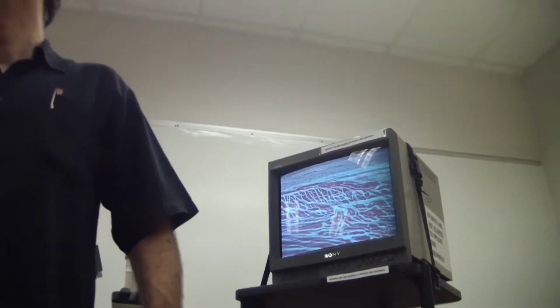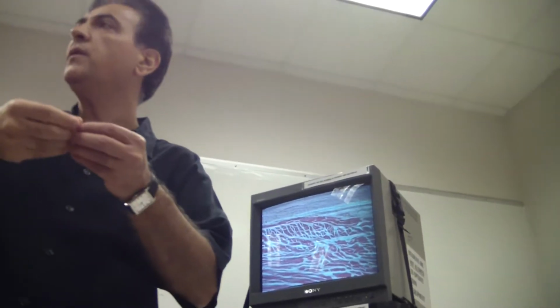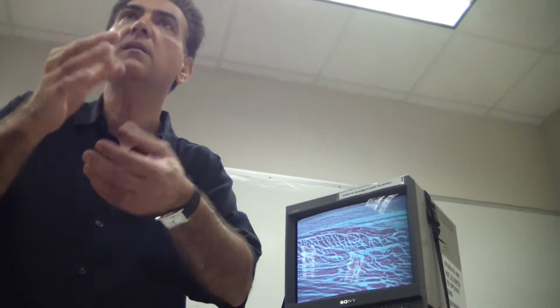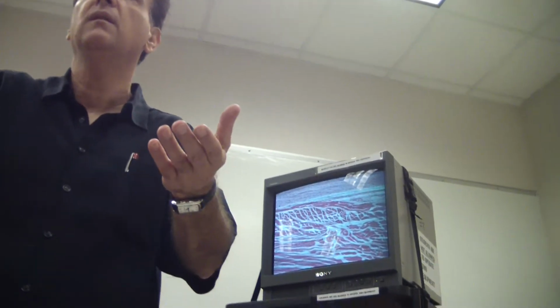When they say circular, that means goes around. When it says longitudinal, it means they're elongated. So not in a sense that they're circular, understand that. These are smooth muscles. Smooth muscle is smooth muscle.